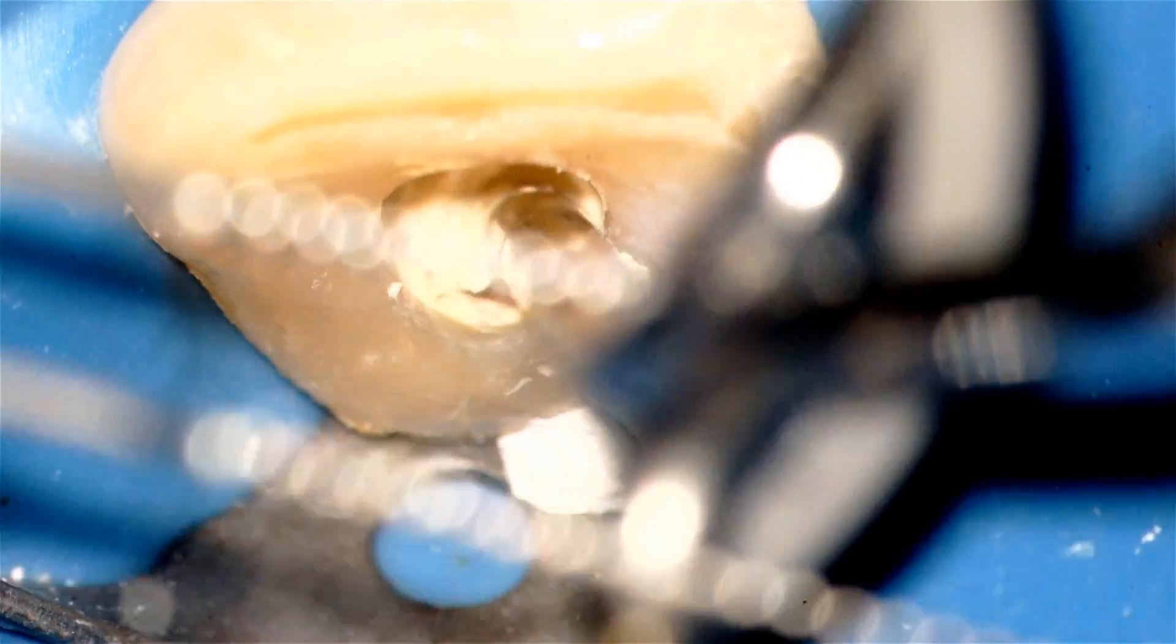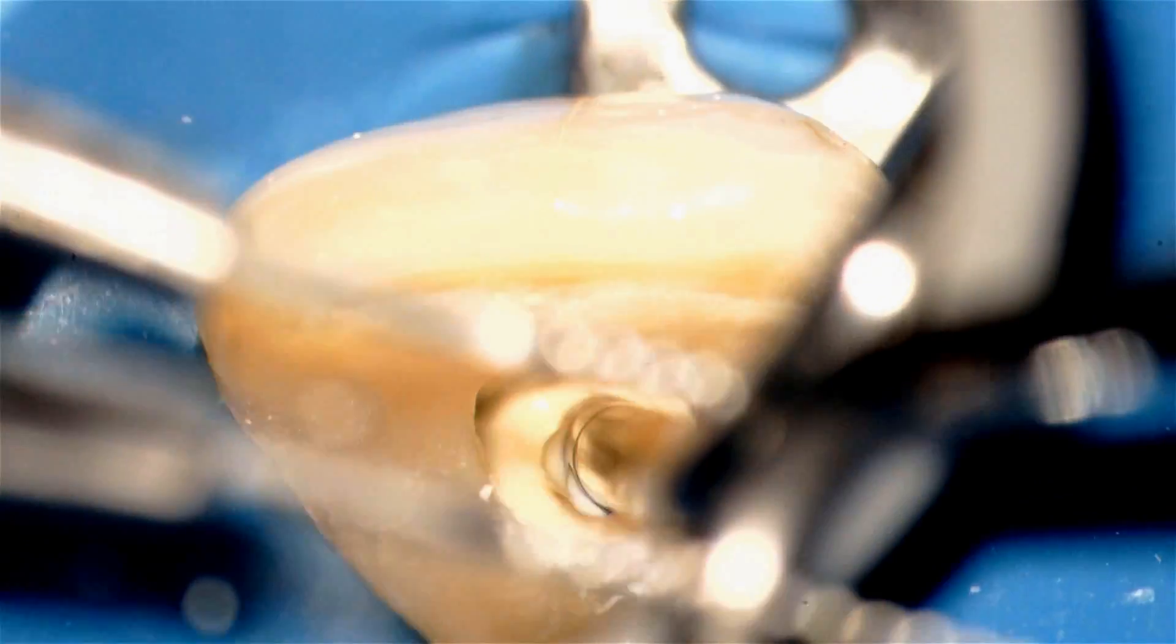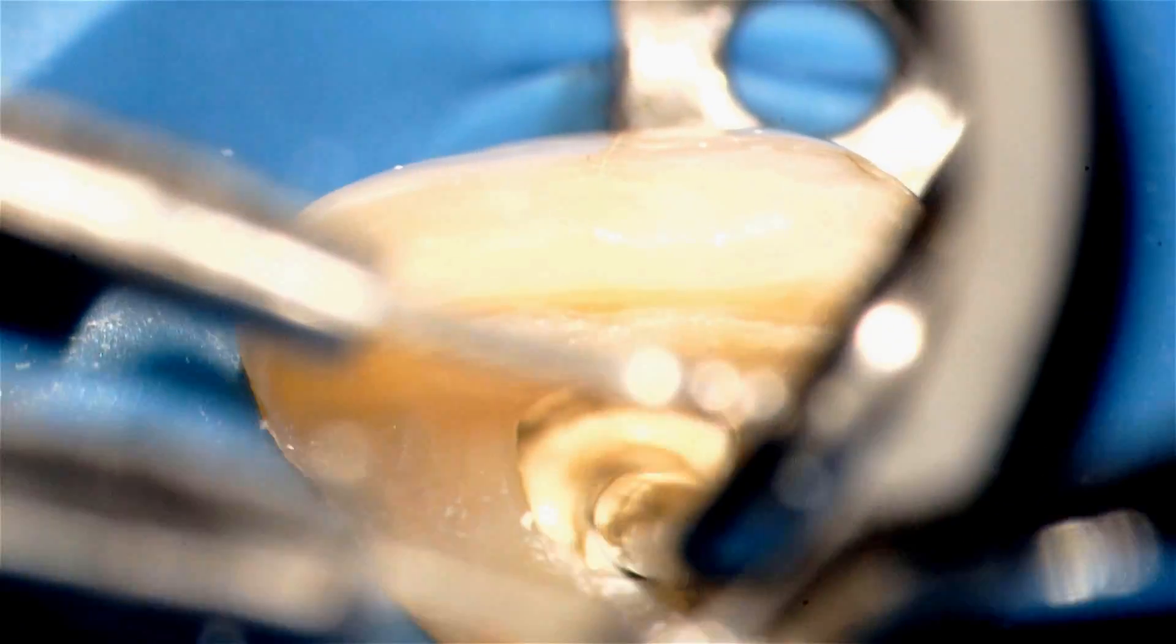You can see how I do this repeatedly, and I'm getting the Biodentine to flow very nicely into the lingual and distal lingual defect. There it is. There's the Biodentine placed.